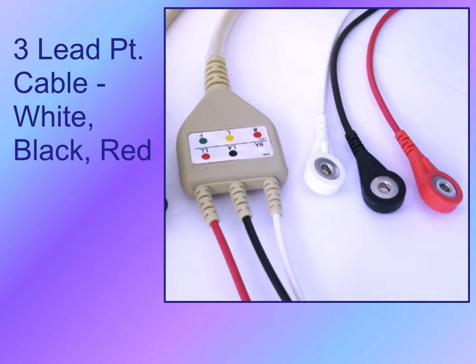There are two different styles. There's a 3-lead and a 5-lead. On the 3-lead patient cable, there's a white, a black, and a red. And you can see on the connection points, they're labeled as to where they would go.